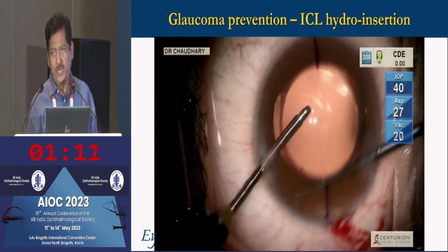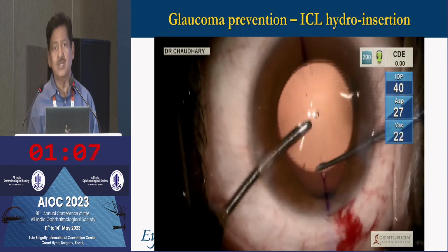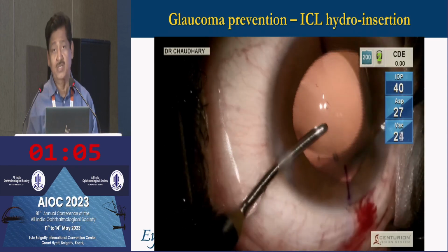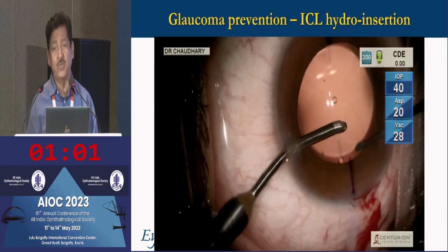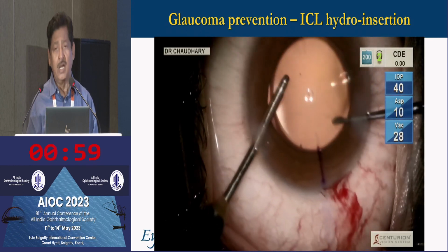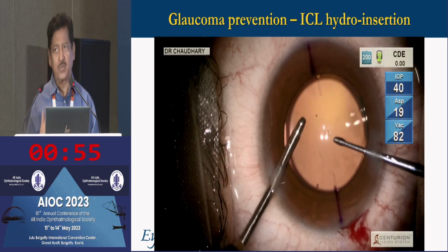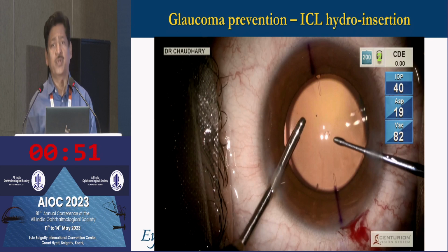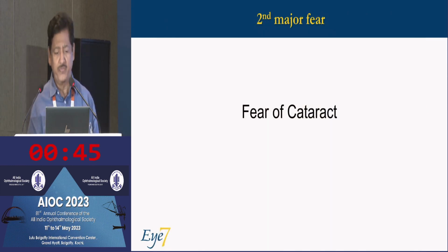It looks very simple. The whole procedure is done in just 5 minutes. 30 ml of fluid. No visco, no early rise of IOP. I am kind of sold to this kind of a procedure, and that is why I talk about it. But then the problem with people is that early users, beginners may face a problem.